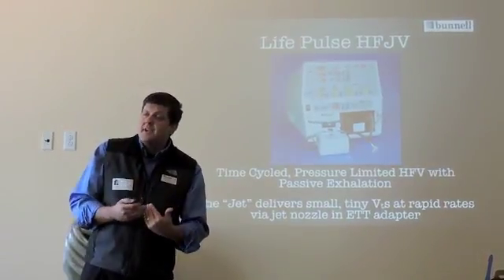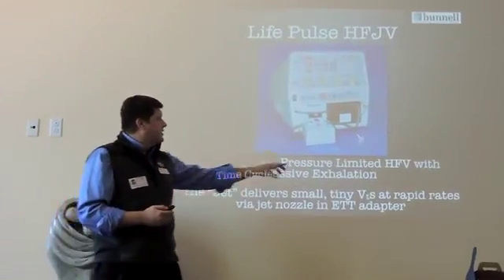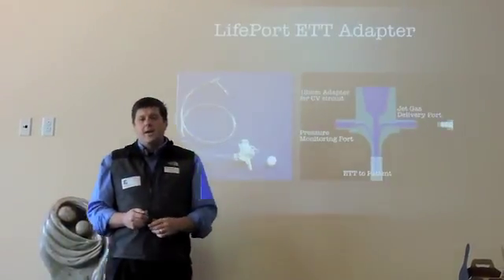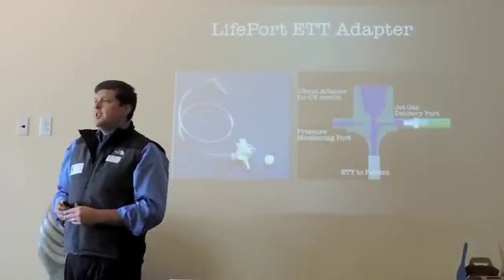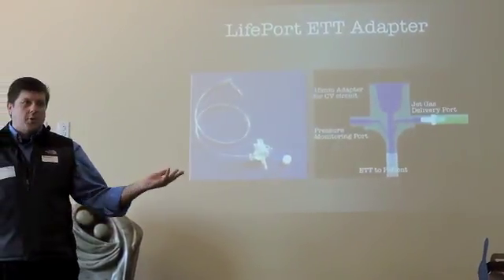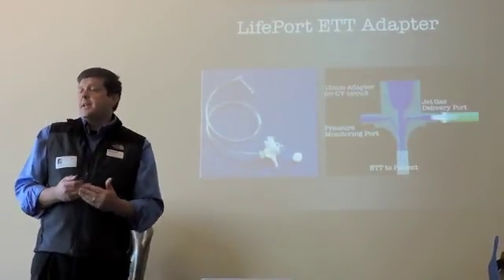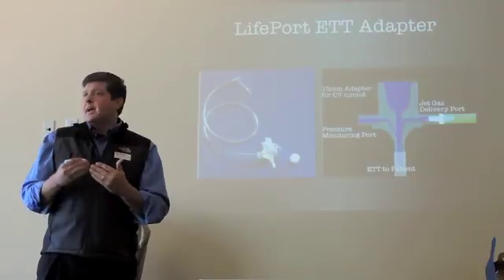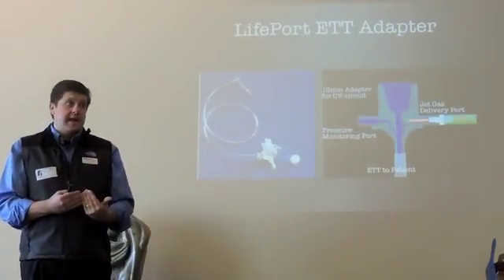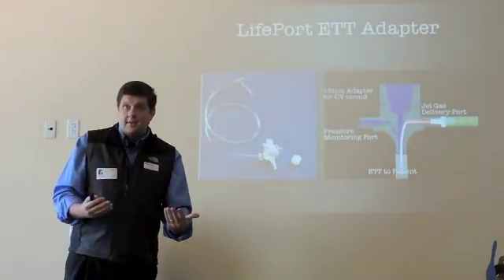Now, how the jet delivers those high frequency pulses and those tidal volumes is via this little special ET tube adapter here. When you use the jet, you have to change out the existing ET tube adapter with what we call the LifePort jet ET tube adapter. But guys, the adapter does a lot more than just allow you to connect the conventional and the jet together. The little adapter here is actually what makes the jet a jet, okay?